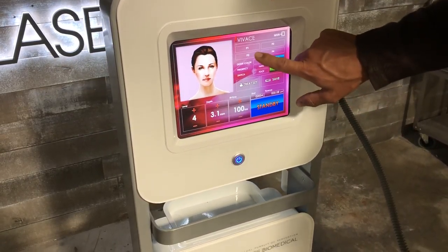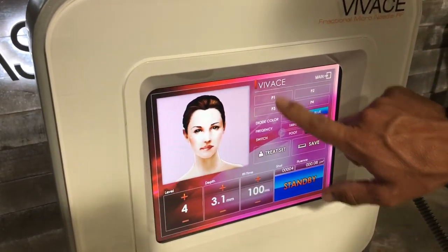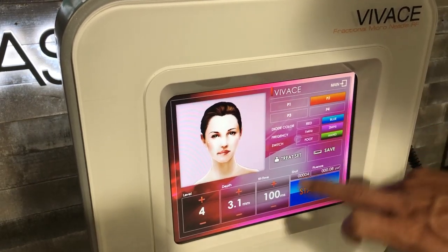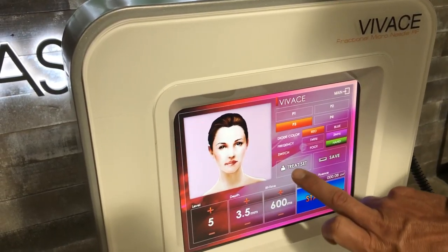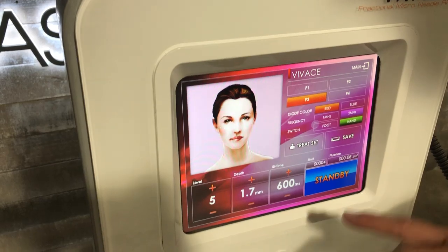If you want, you can pick zones — there are four zones and they break it down by face and neck. If you select one zone, it'll give you the depth level. Switch it and save as a treatment set and it'll change the depth level based on where you are on the face. That's kind of nice.